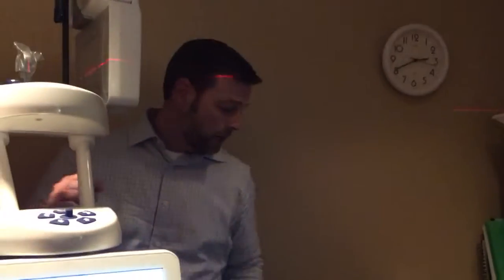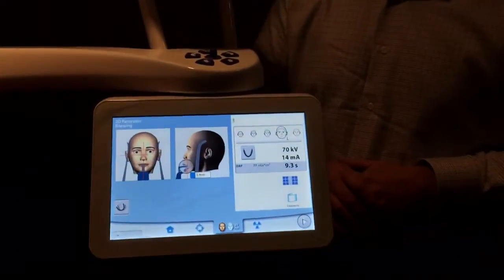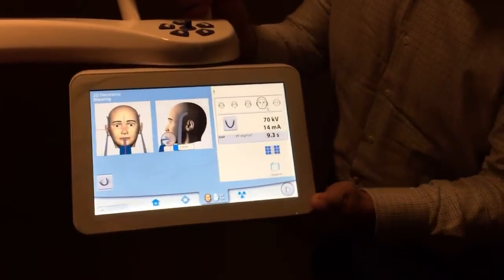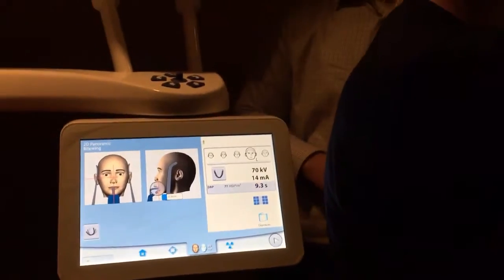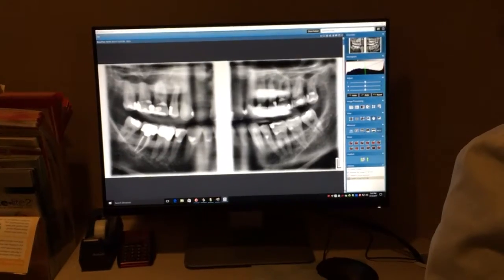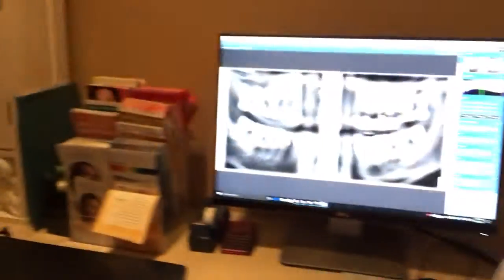Ways you'll mess up: she's never done a cone beam, so when you do a cone beam you move the laser to be in front of the front teeth. That's only for cone beam — not for pan. Now, looking at this image: we've got a slight smile in there so it should have been flatter. See how the anteriors are out of focus and fuzzy? That means it was out of the focal trough. If you have it set to two, everything is clear. This was way too far forward, probably left from a previous 3D scan.